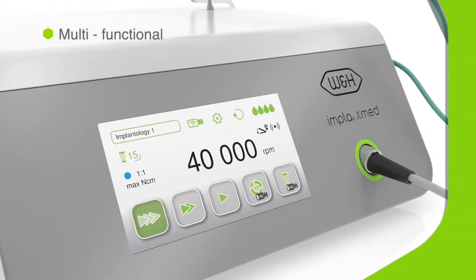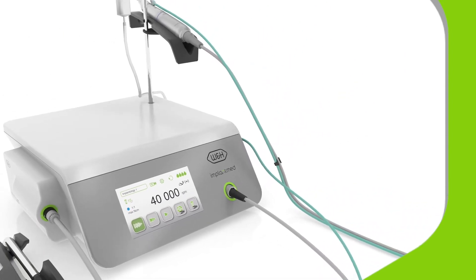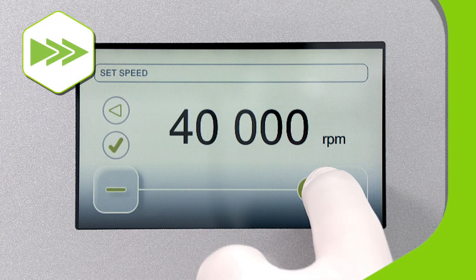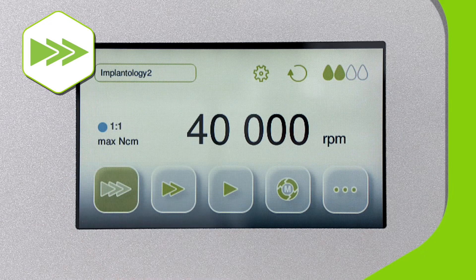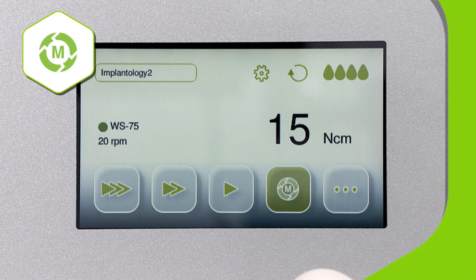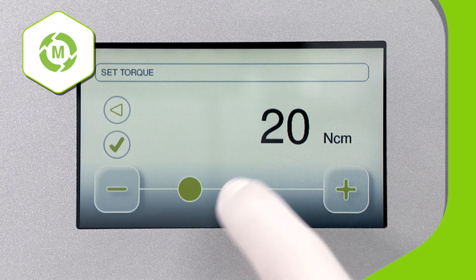ImplantMed Plus supports everything from osteotomy to threading to implant insertion. The osteotomy settings provide controlled guidance for all types of operation into the bone and supply the correct amount of coolant via the easily adjustable hose. The thread cutter function provides support when inserting implants into hard bone and promotes stress-free healing by preventing compression.